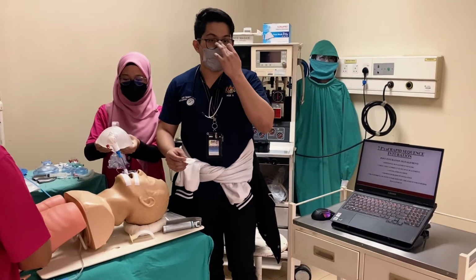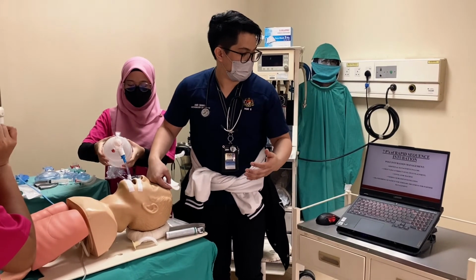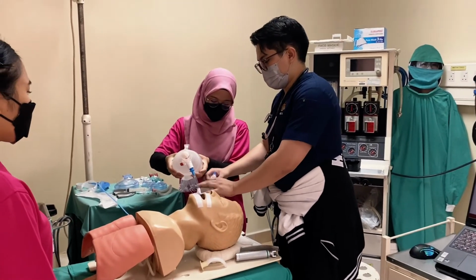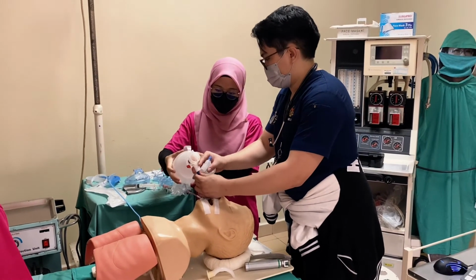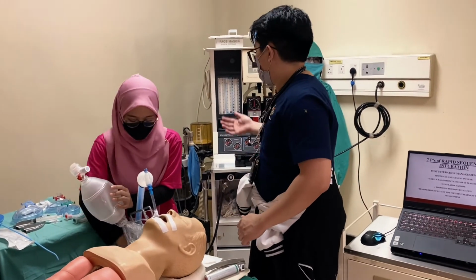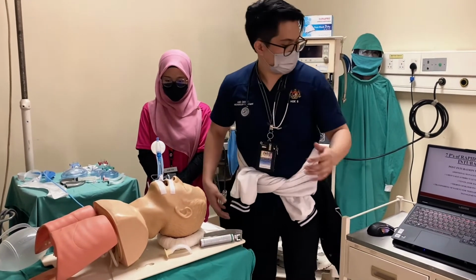And the additional management includes a chest X-ray of the patient to see the correct level of the placement of the ETT, and connection of the ventilator machine, as I said before. After the intubation, for instance, we'll connect the machine. After the ventilation, we check the machine is okay, disconnect from it, and then let the machine ventilate by itself. Just an example: in a ventilation setting, this machine will help the patient ventilate by himself, or the machine does it for him.